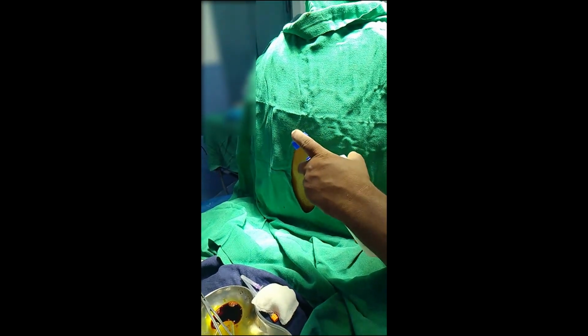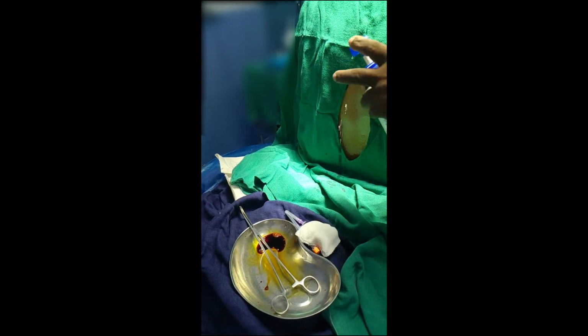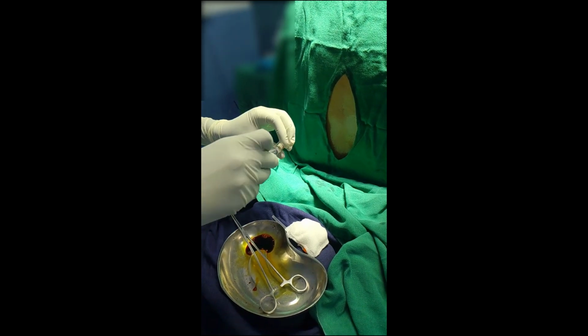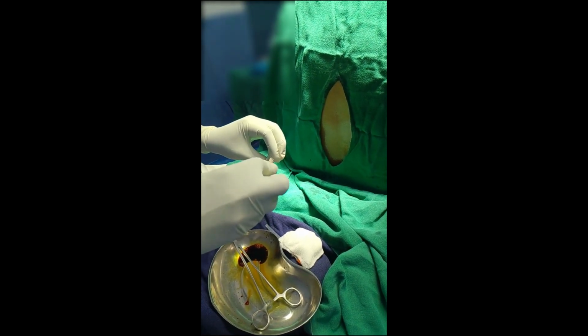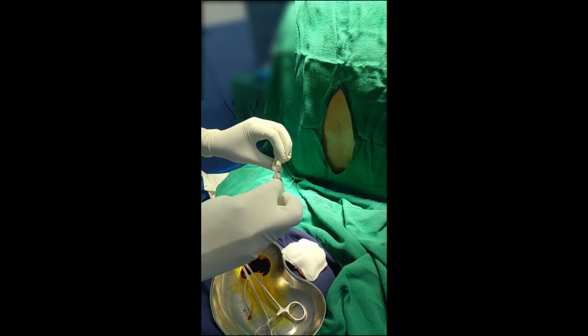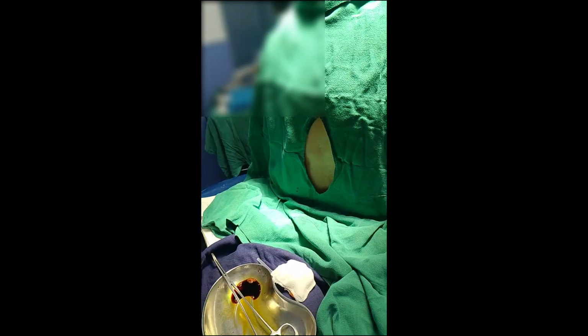Injecting the drug or the needle where there is already betadine present is quite dangerous. It can cause chemical meningitis. So make sure everything is clean before you start to inject the drug or before you start to inject the needle.